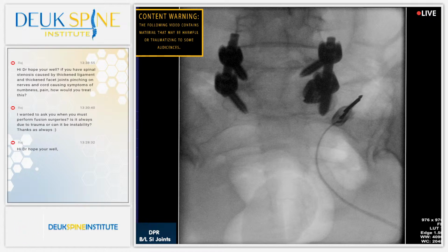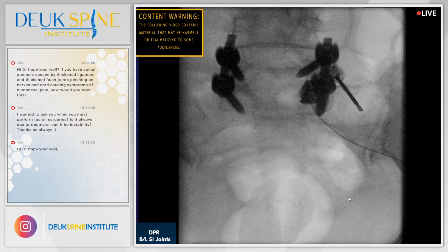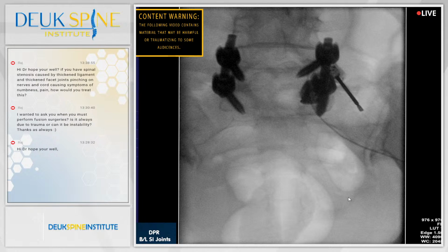You could show us the joint, by the way, so everyone can see. That's it. The good news is that as we move down towards the feet, the joint becomes more shallow. We call it superficial. It's not as deep.